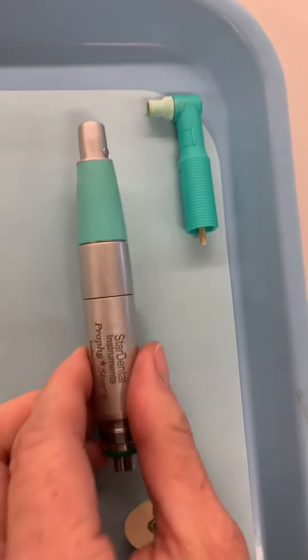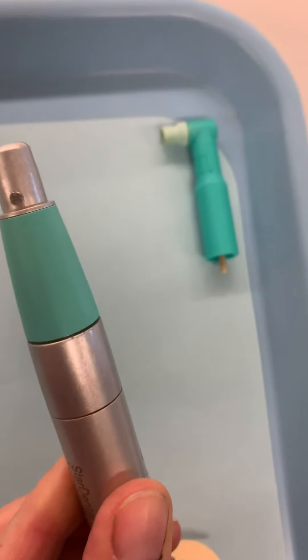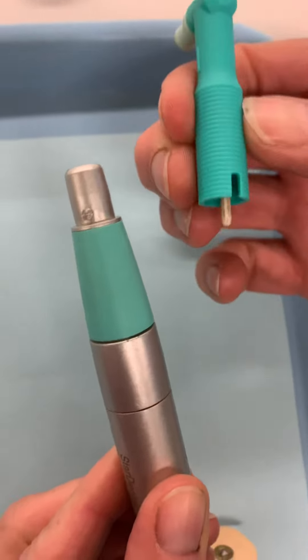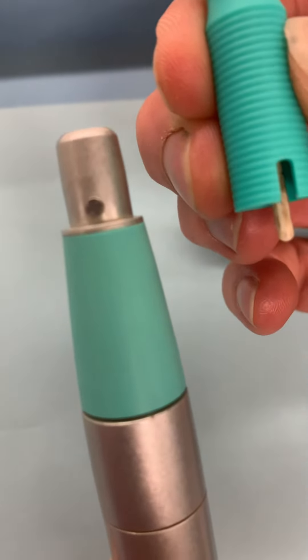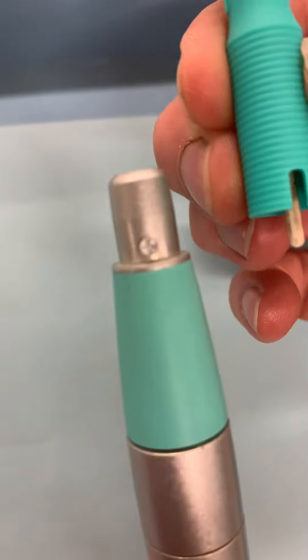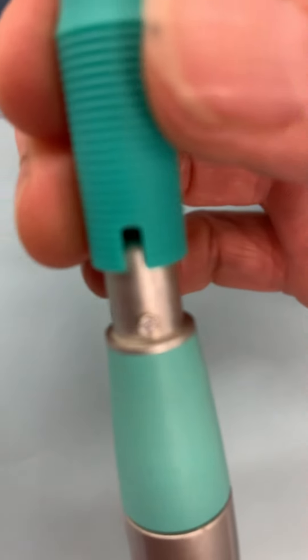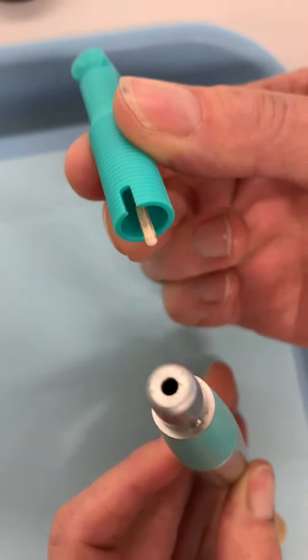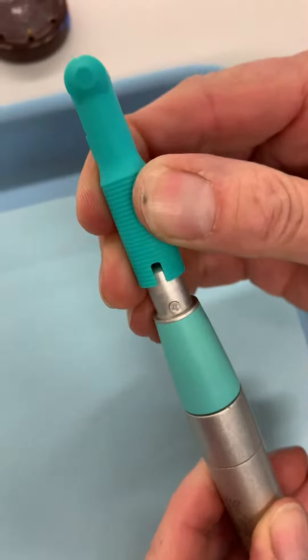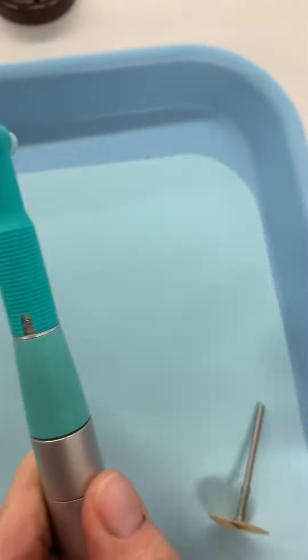Now let's look at the coronal polishing handpiece, or the hygiene handpiece. The profi angle is right here — it's going to slide down. You see the little notch here; that notch is going to line up with this little groove. The little white part on top is going to slide in, and then you push it on down over that little notch — and there you go.